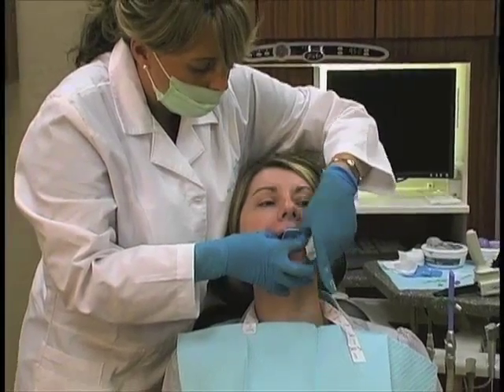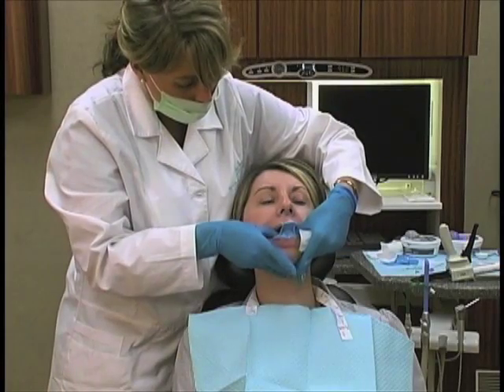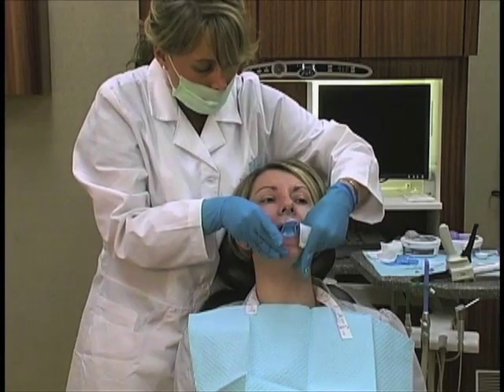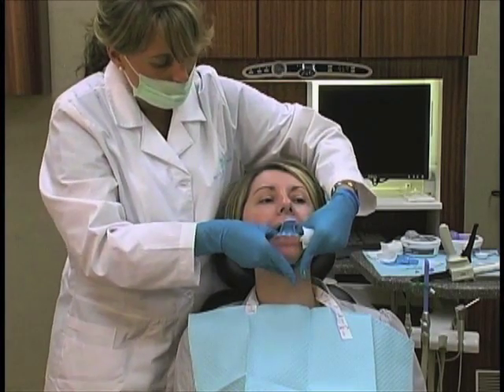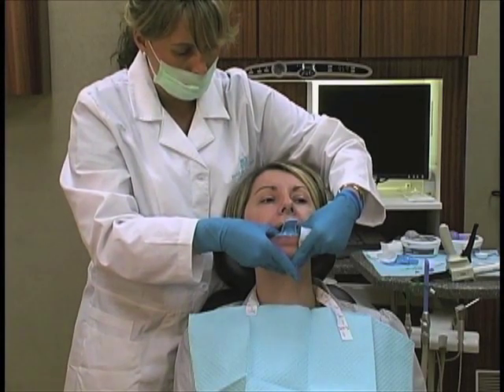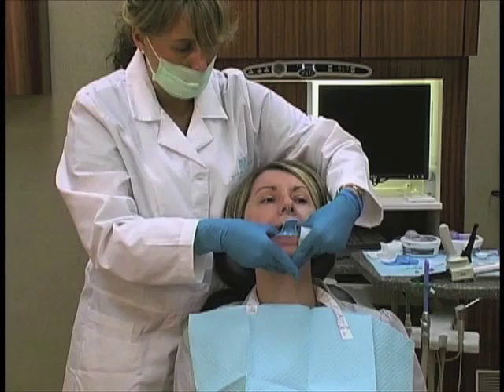And so what I would tell you is that if you're finding that the team is having trouble getting either opposings or your diagnostic impressions as accurately as you would like with alginates, consider using the Flex Time putty technique as we've shown you, as Dr. Buckle showed me, and we've really been pleased with its results.